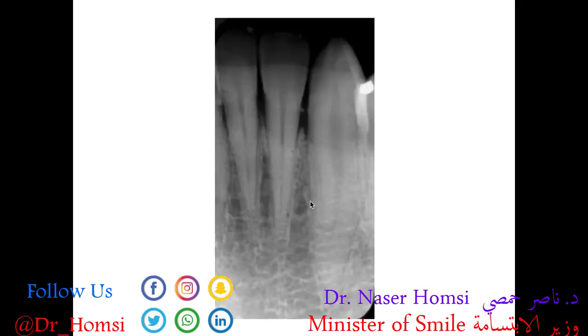In this anterior periapical we can see a small triangular radiopacity at the junction between the enamel and the root. The root is lined by a thin layer of cementum and then dentin underneath. This area is the CEJ — the cemento-enamel junction — where the enamel and cementum layers meet. If a patient has a lot of tartar buildup, this is where we would see calculus. Calculus is mineralized dental plaque and shows up as a radiopacity because it has mineral content that attenuates some x-rays. That patient would be in need of a deep cleaning.